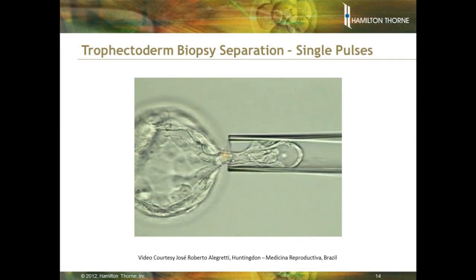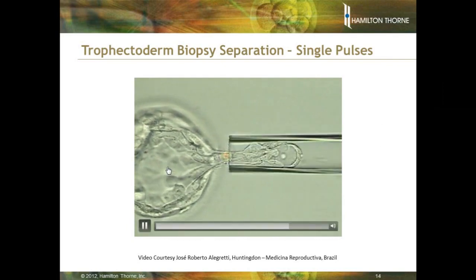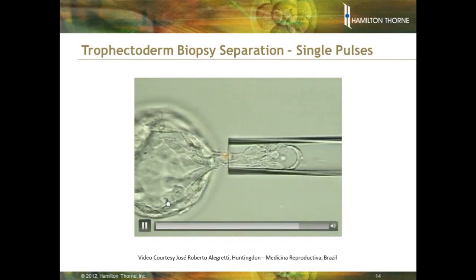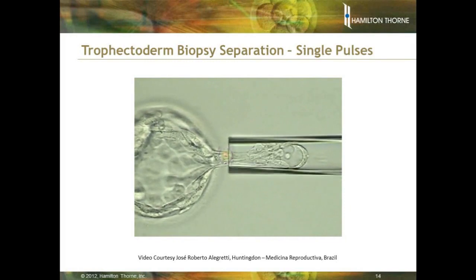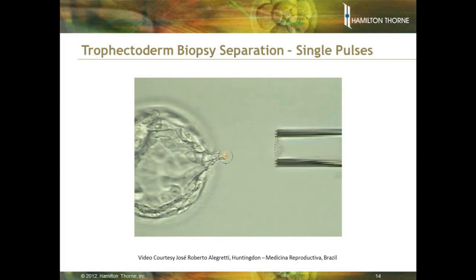Each twitch weakens the bonds between the biopsy and the rest of the embryo. And at the end of it, one is able to separate the biopsy with a minimum amount of time and therefore a minimum possible problems due to that.